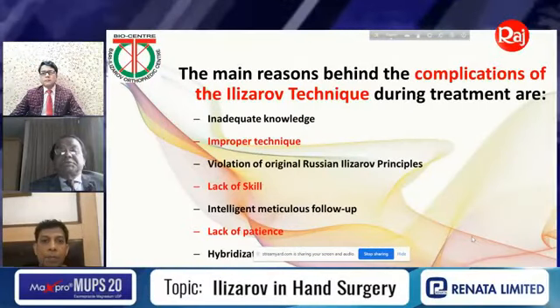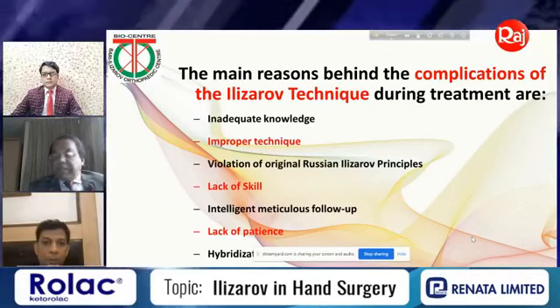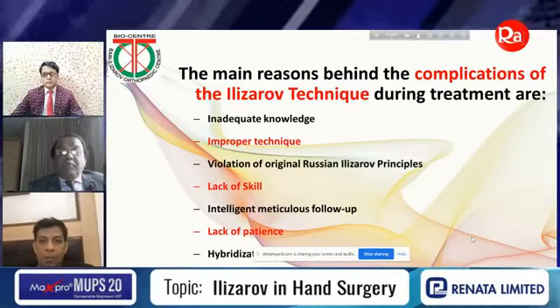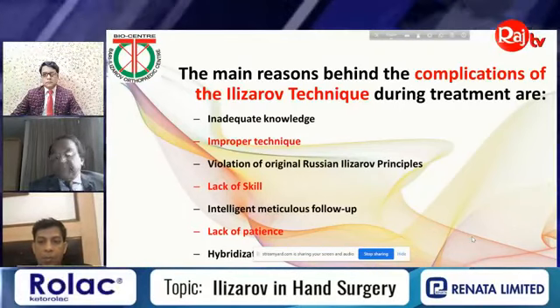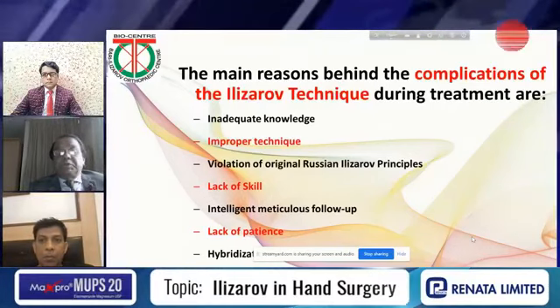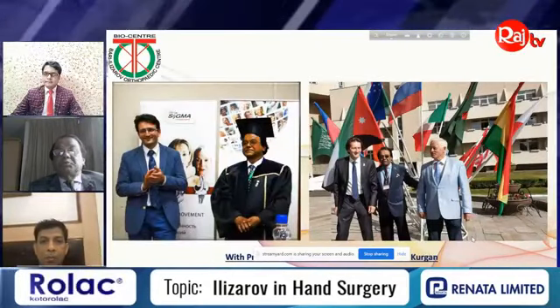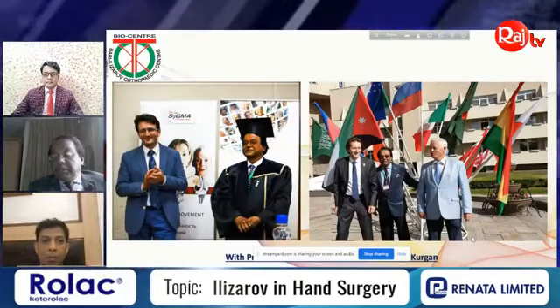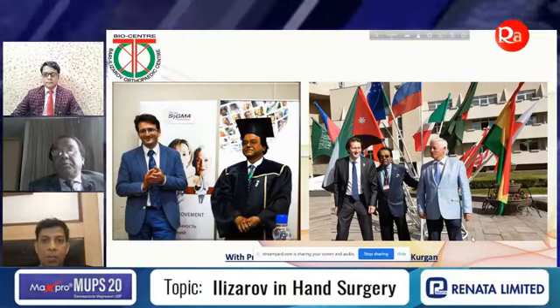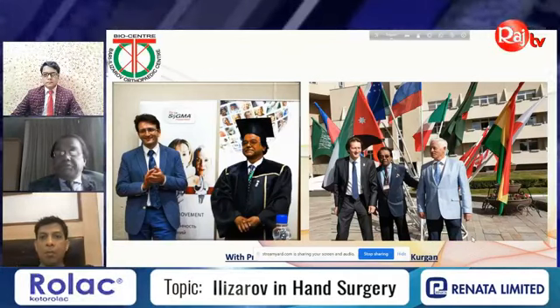So I always tell this, complications of the Ilizarov technique during treatment are inadequate knowledge, improper technique, violation of the original Russian Ilizarov principles, lack of skill, lack of intelligent meticulous follow-up, lack of patience, and hybridization. So these are the few cases that I have shown you, how you can put the Ilizarov in closed and open trauma cases of the hand.